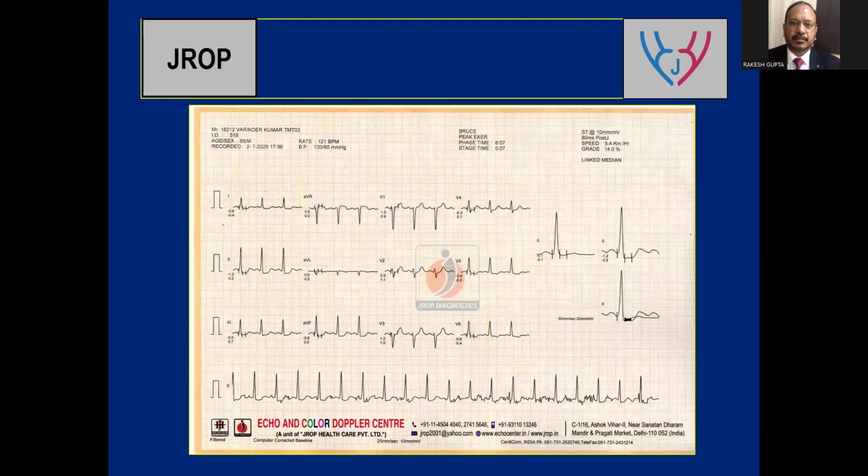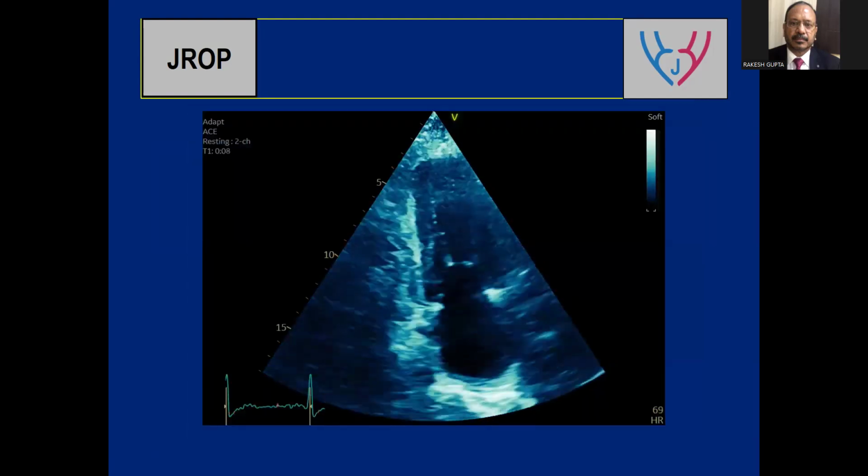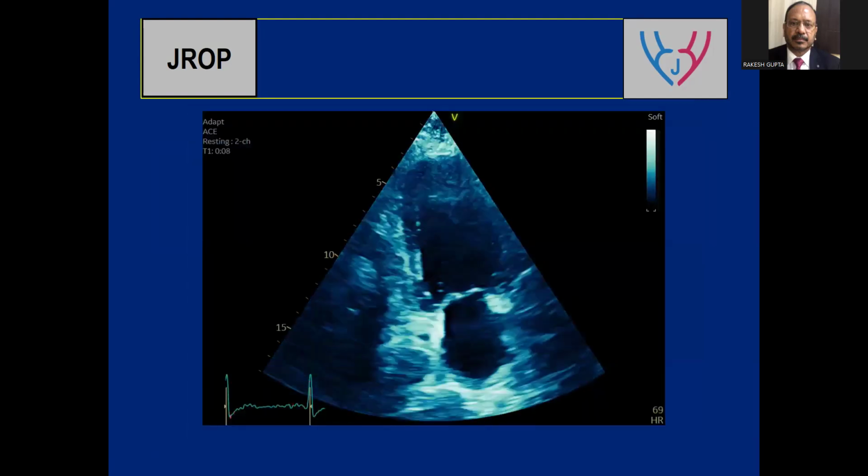And if you go back to that ECG, it classically shows ST segment depression in leads 2, 3, aVF, and it is showing at V5, V6. Now there is a poor progression of R wave, but the diagnosis lies somewhere over here in circumflex territory. Last, if you have basal septum, basal inferior wall involvement without any lateral wall, think of an RCA territory.